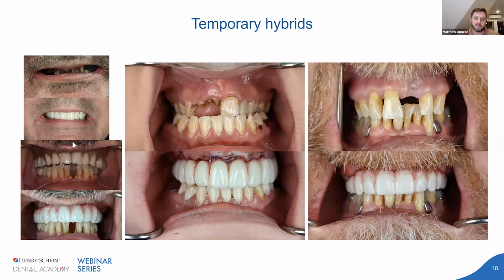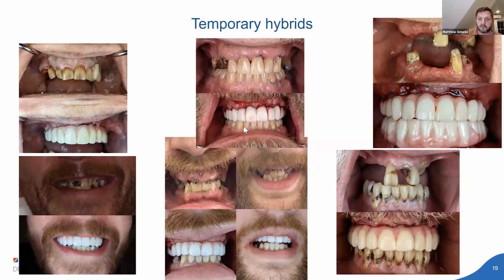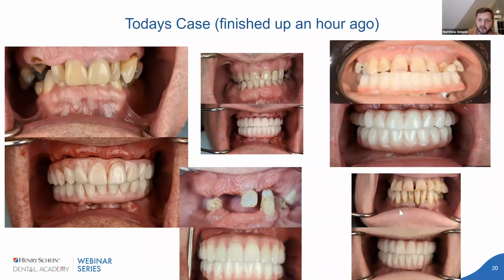Like I said, we jumped into implant dentistry doing single units 7, 8 years ago, and included this by adapting 3D technology plus the changes in implant protocols. So just, again, some of the cases. Like this bottom right one was 2 days ago, but these are all 3D printed temporary hybrids, before and afters, all same day, all of them in a matter of a few hours.